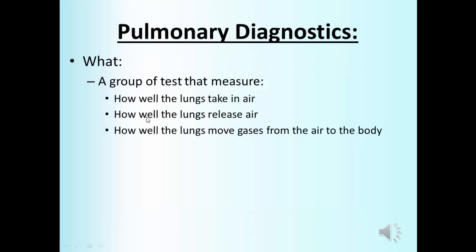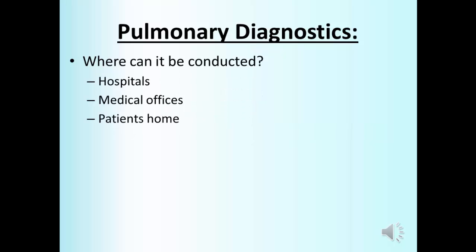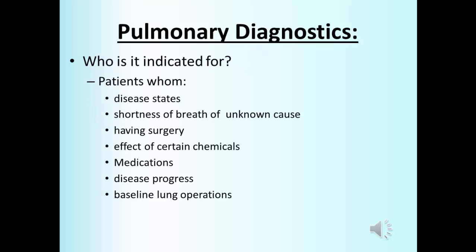So, what are pulmonary diagnostics? They're a group of tests that measure how well the lungs take in air, how well they release air, and how well they move gases from the air to the body. They can be performed in hospitals, medical offices, or even the patient's home.